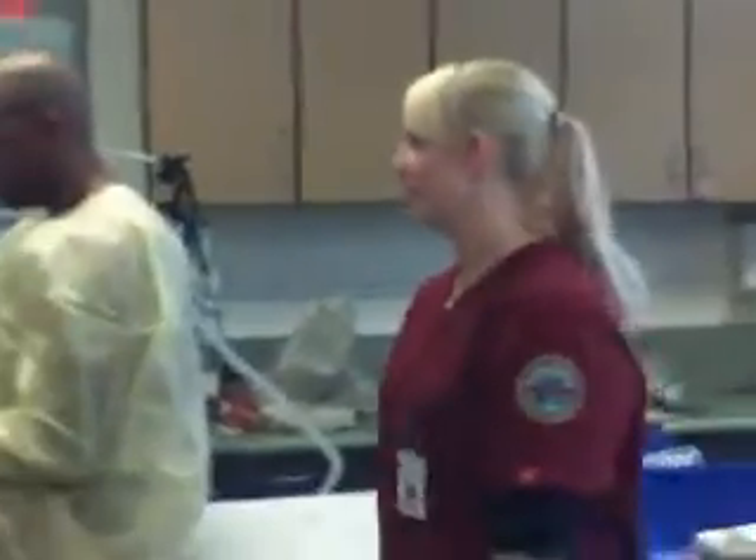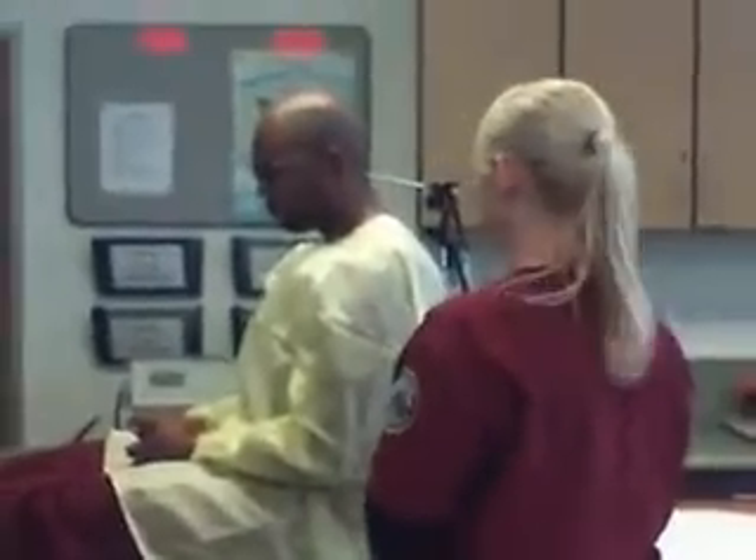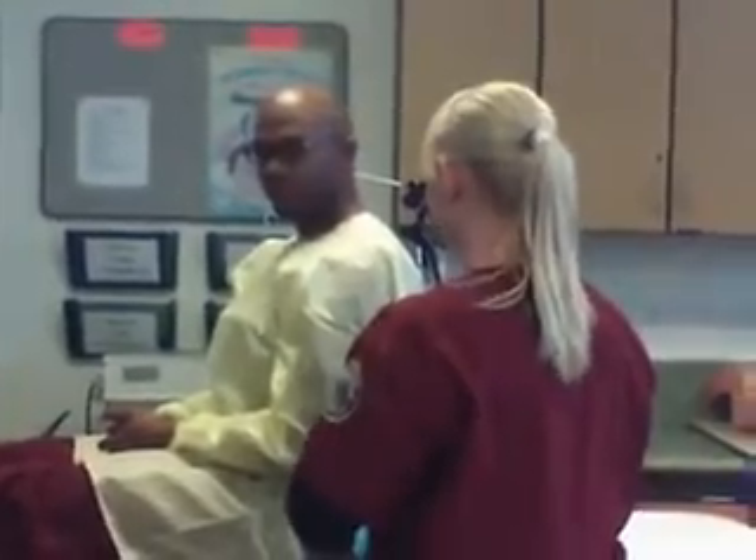Amanda's going to identify herself to our patient. "Mr. Simonson, I am Amanda from Respiratory. I'm here to give you an EKG."